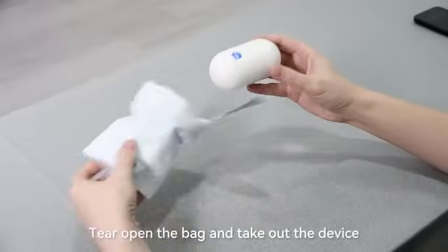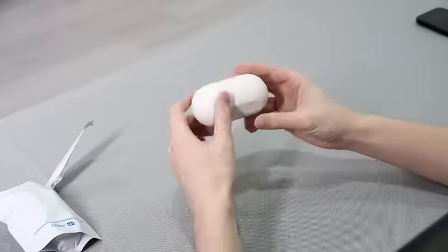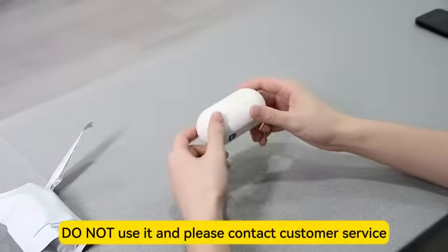Tear open the bag and take out the device. If the device is broken, do not use it and please contact customer service.